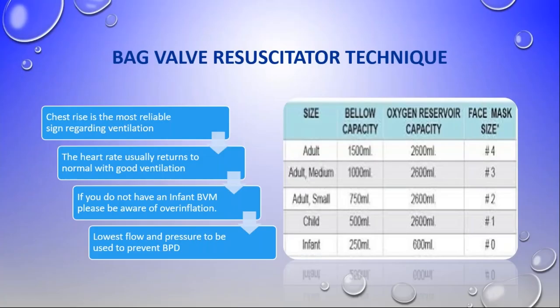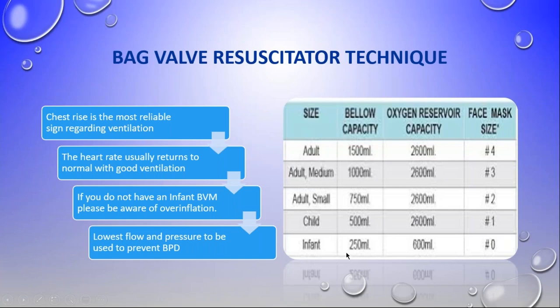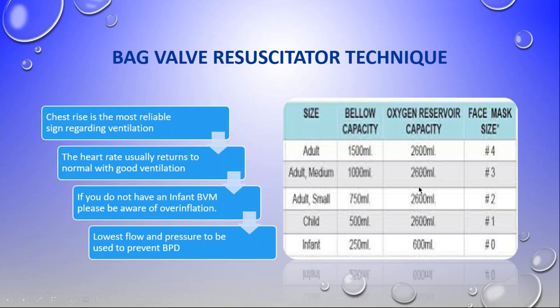When we look at the bag, we cannot actually use an adult bag to resuscitate an infant. Look at this adult bag and how many liters of oxygen it requires versus this bag here. Look at the capacity. This part here is this part here. This part here is this part here. You cannot be using these huge big bags for this.